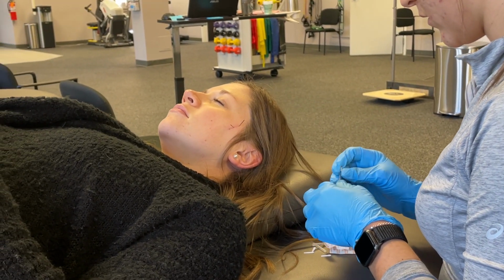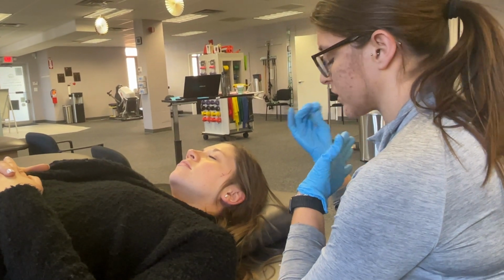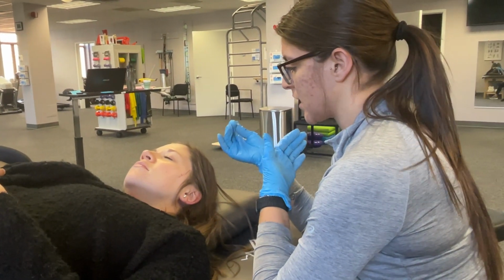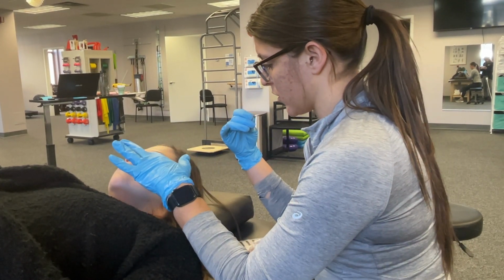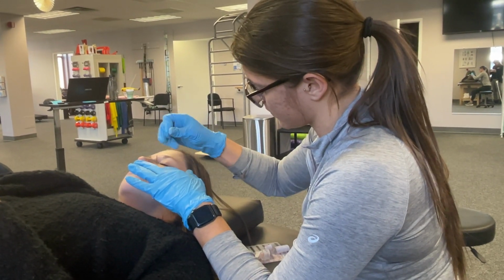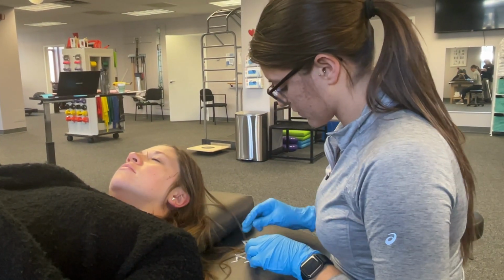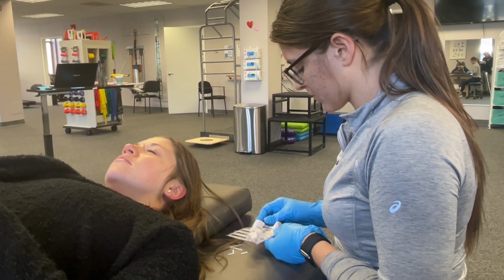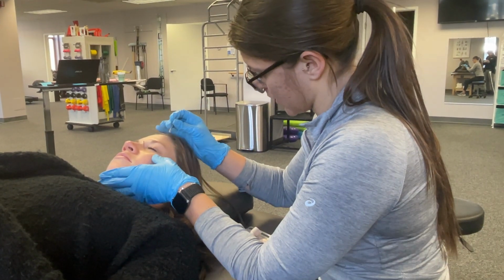Okay, so from here we can place our needles in a few different positions depending on what specific symptoms the patient is reporting. So for example, if they have headaches associated with the TMJ dysfunction that is located along their lower orbital region or their zygomatic arch, we can also stick a needle right over the bone there. And another one into the zygomatic arch more laterally.